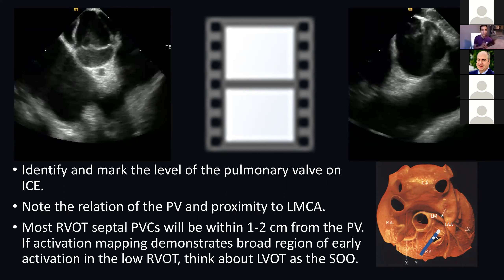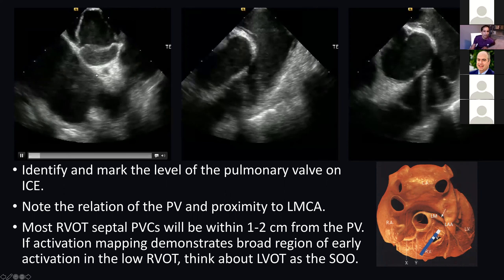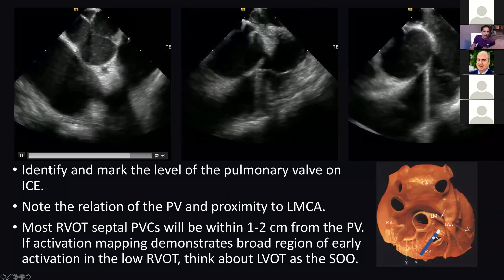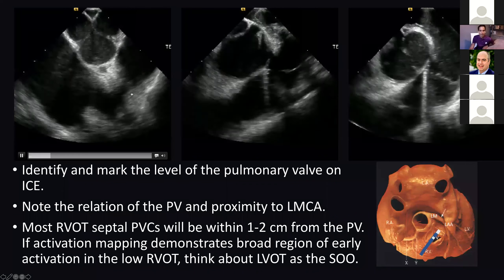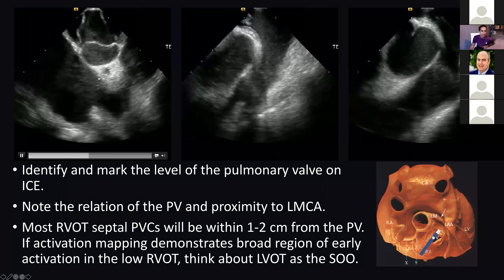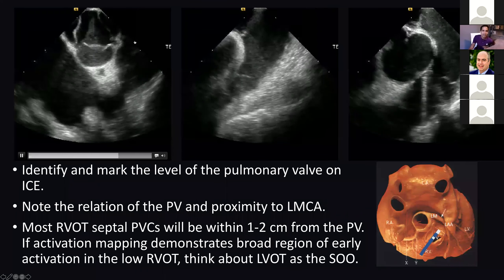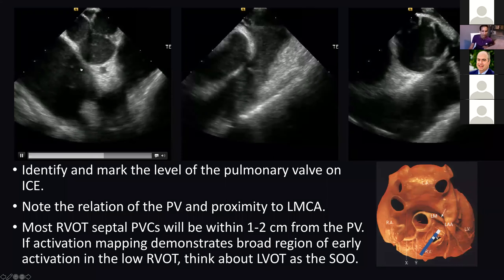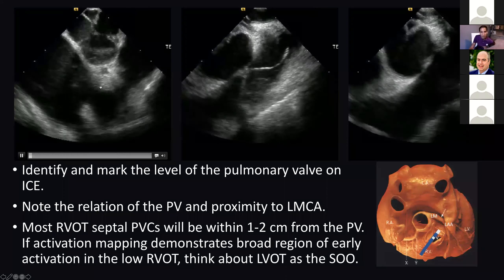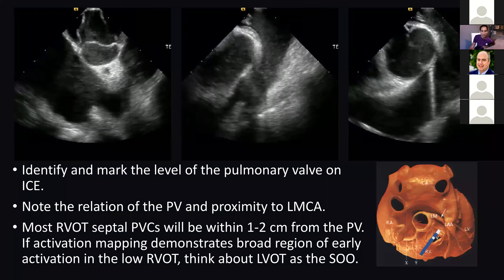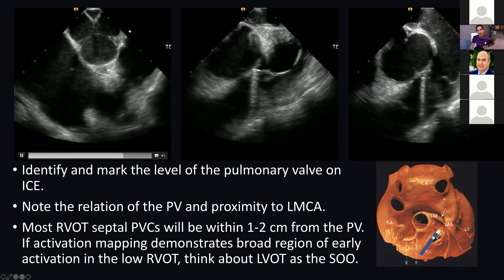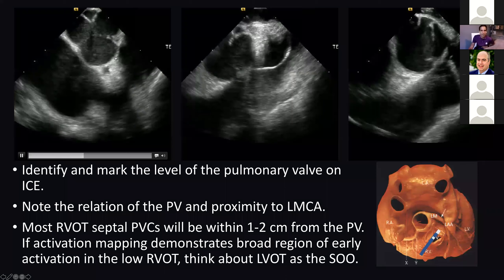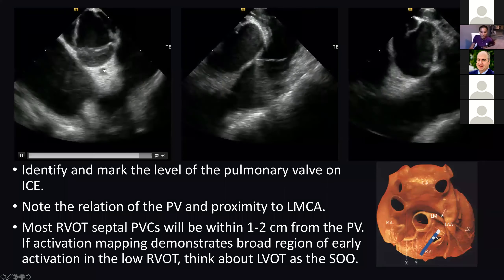The first thing I'd like to do is get the short axis view of the area and see the left main coronary artery take off. You'll also see the pulmonary valve coming into view. Characteristically, the left main is at the 9 o'clock position, the pulmonic valve is at 3 o'clock, and the short axis shows the Mercedes-Benz sign of the aortic valve. It's not that hard to underestimate the height of the pulmonic valve using fluoro.